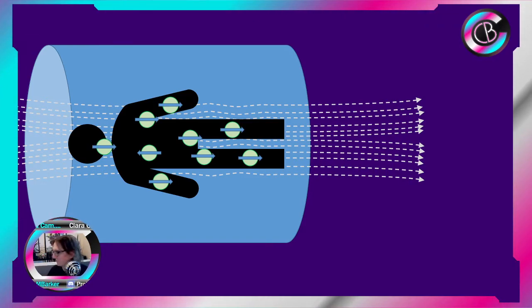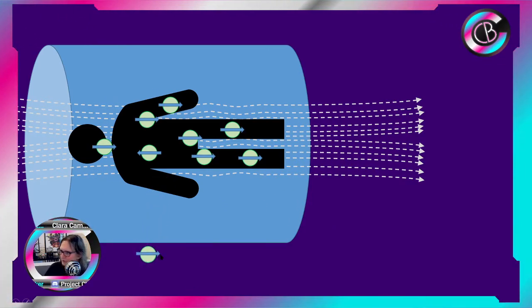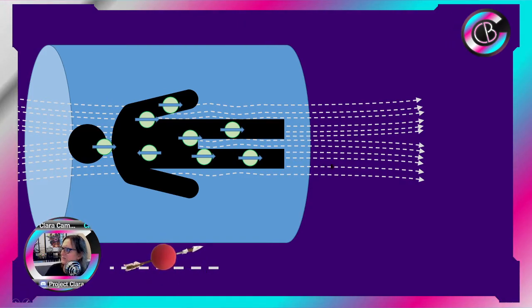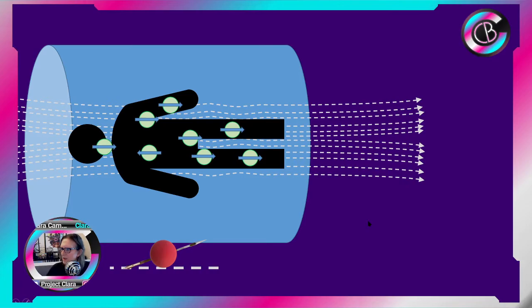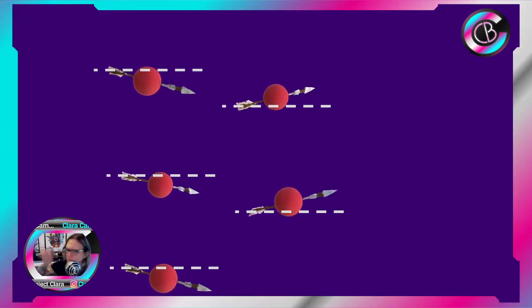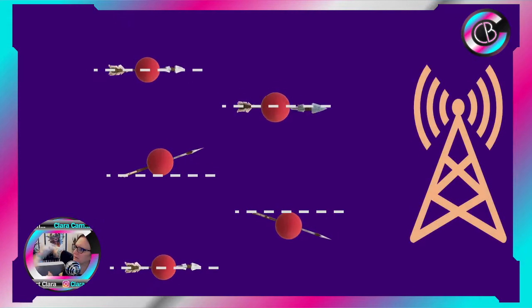That's what's happening. And I'm going to talk about that spin in a little bit more detail just to show you what's really going on. So let's take our hydrogen atom again. Let's make our beautiful 3D model. So now it's spinning. You notice I've changed the axis a little bit, spinning around depending on what that magnetic field is. And like I say, there's loads of them. So they're all spinning out of phase, at different angles.